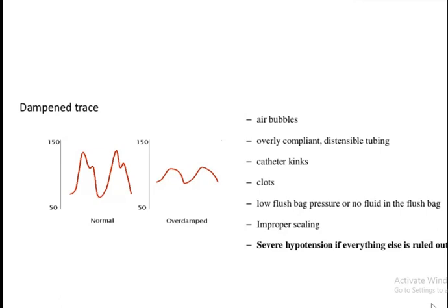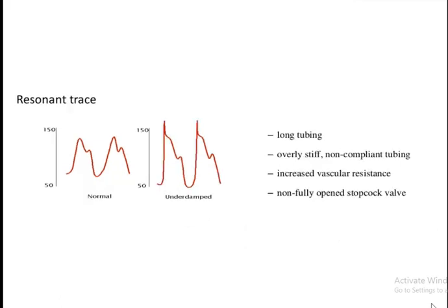You have to act immediately. So now this is another graph, the normal graph, and here you can see very tall peaked waves. So what are these showing? That means this is underdamping, that very high blood pressure recordings are coming normally.